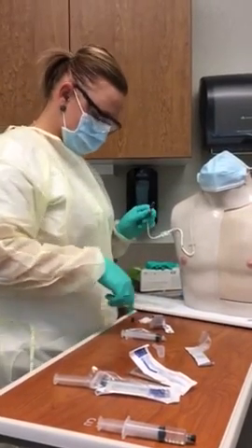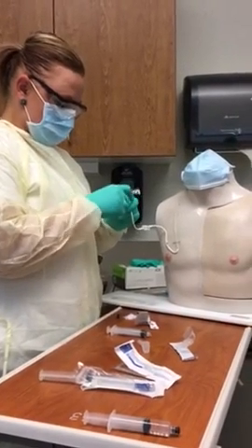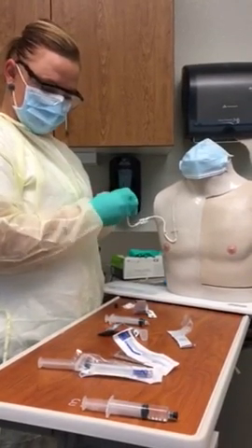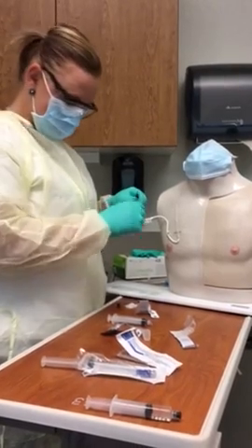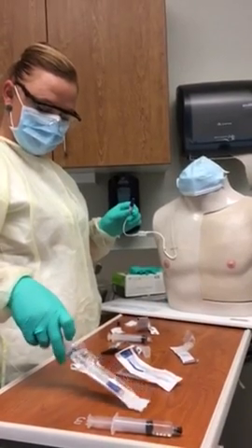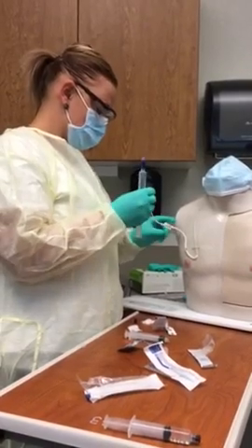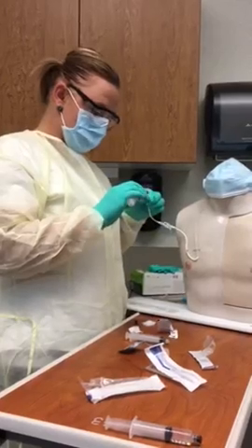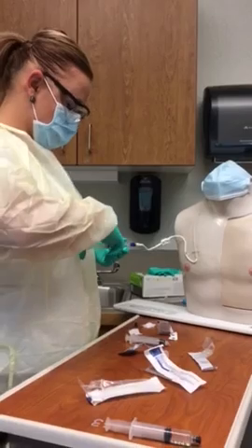So now that I let this touch there, it's contaminated again. I'm going to make sure I clean it again for 15 more seconds. Even though we're changing the cap, it never hurts to clean with alcohol. So we're going to go ahead and get our pre-filled syringe that's been pre-flushed cap out. We're going to make sure that's clamped. We're going to take the old one off. Throw that in the sharps container. I'm going to put the new one on. I'm going to unclamp that and we are going to flush it.